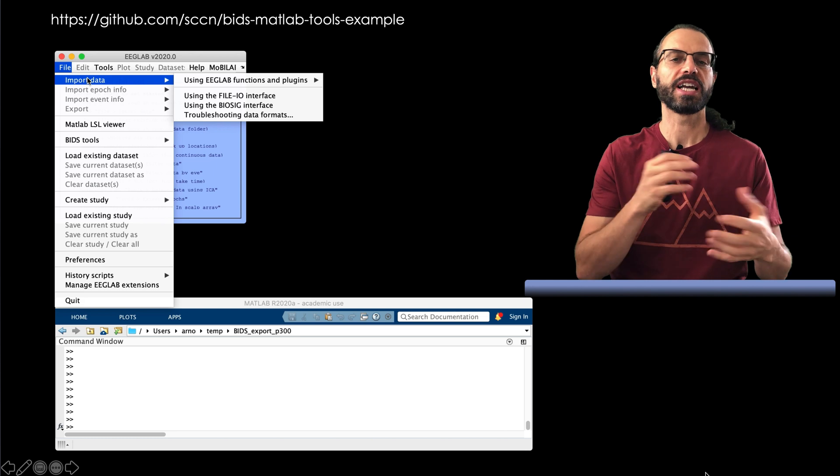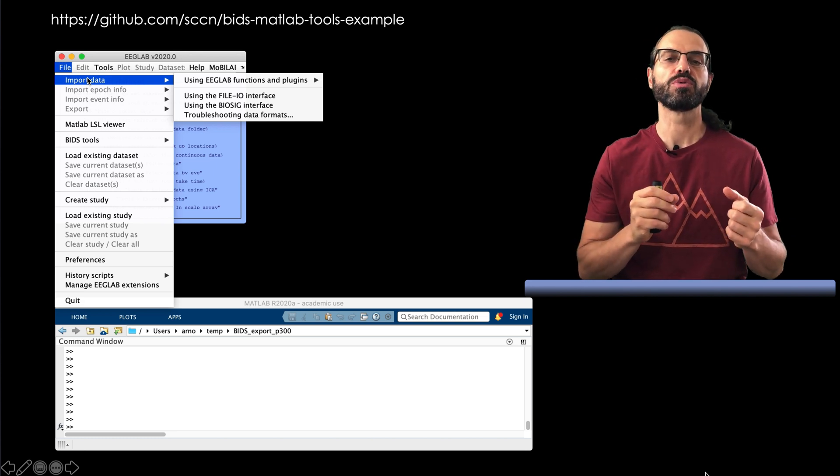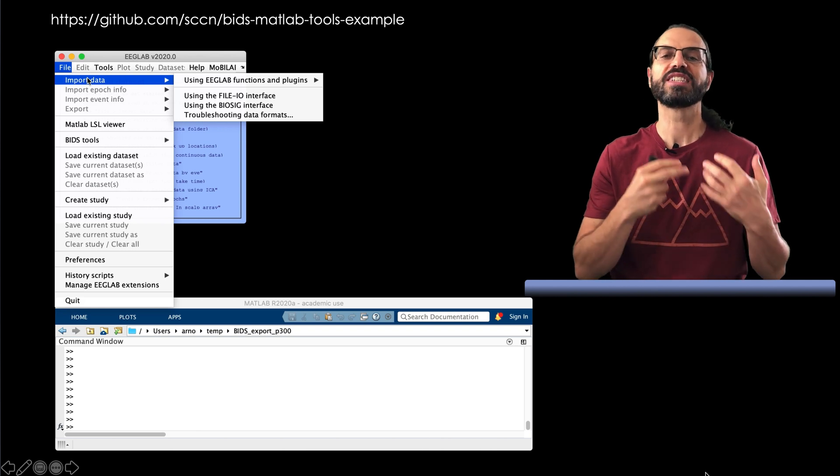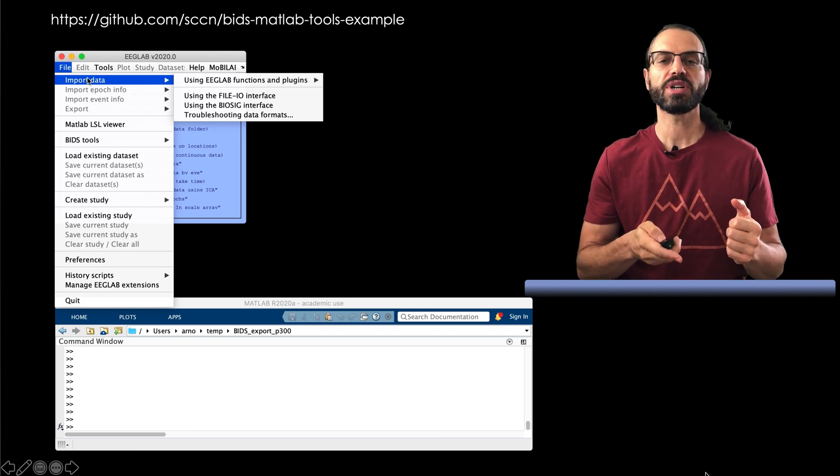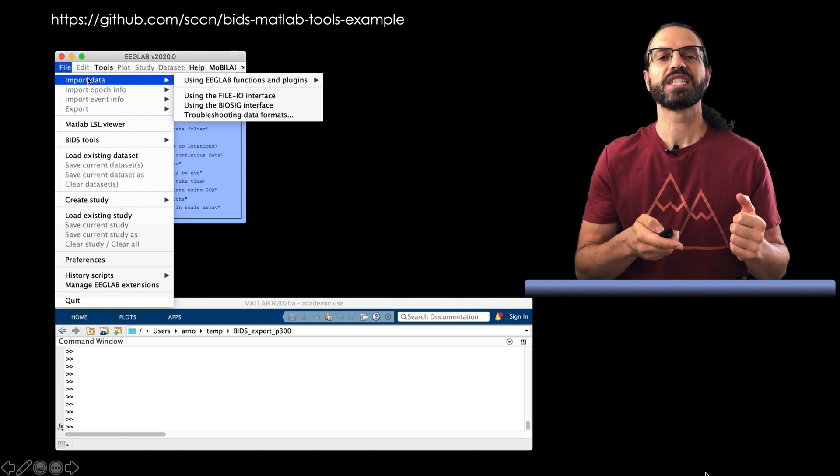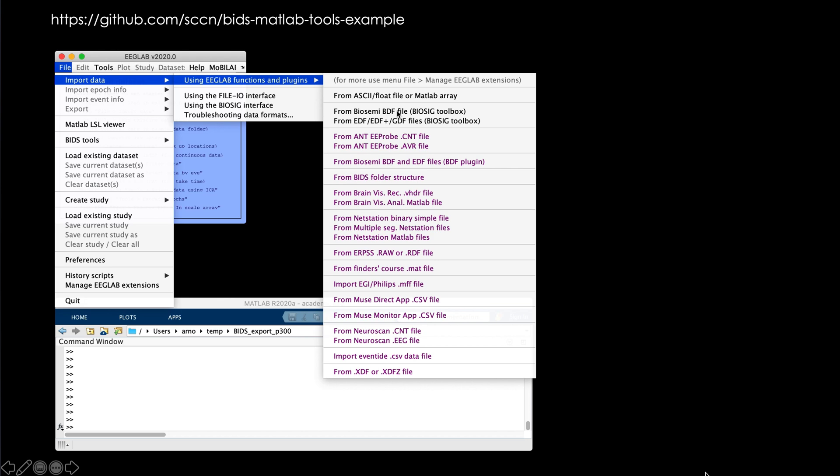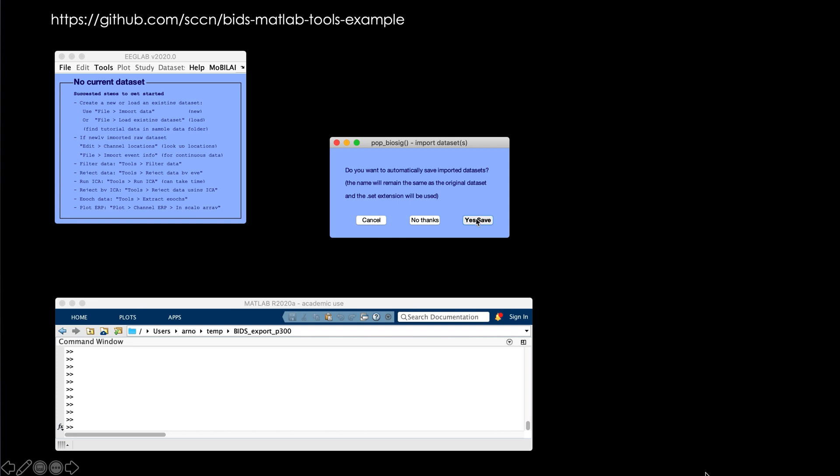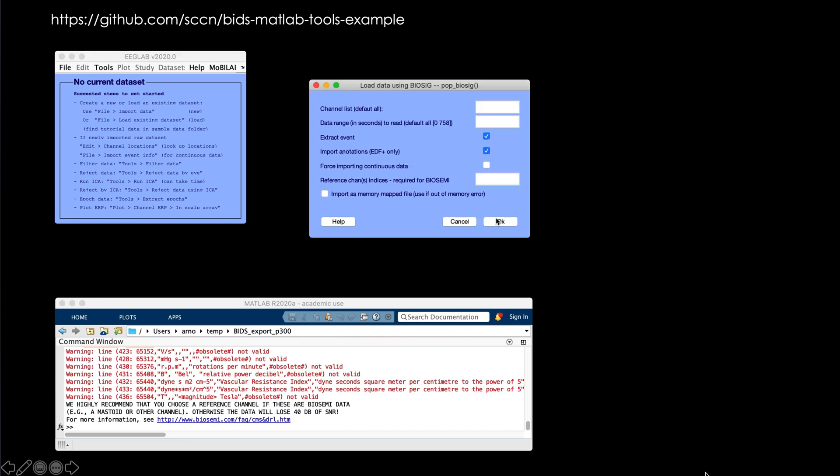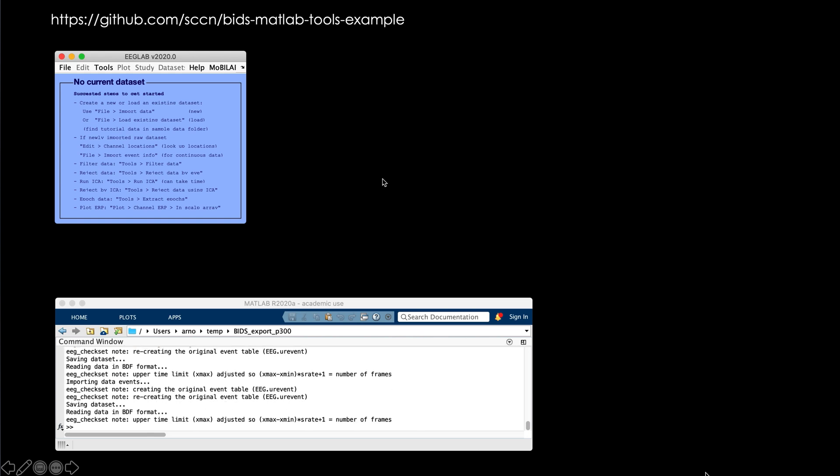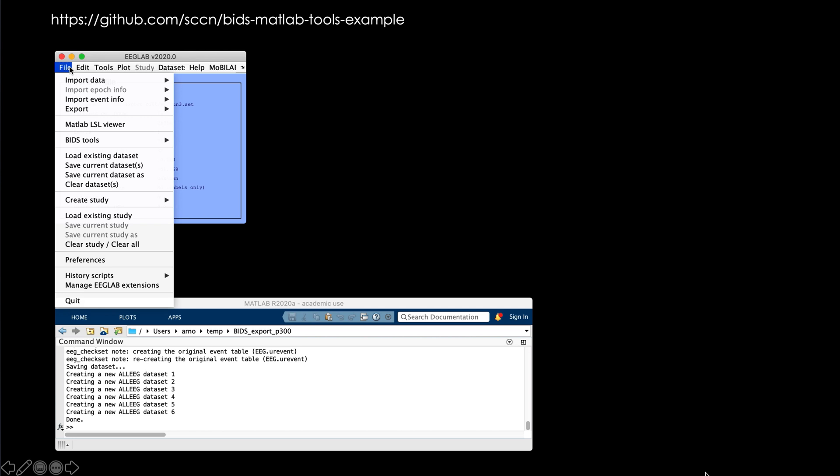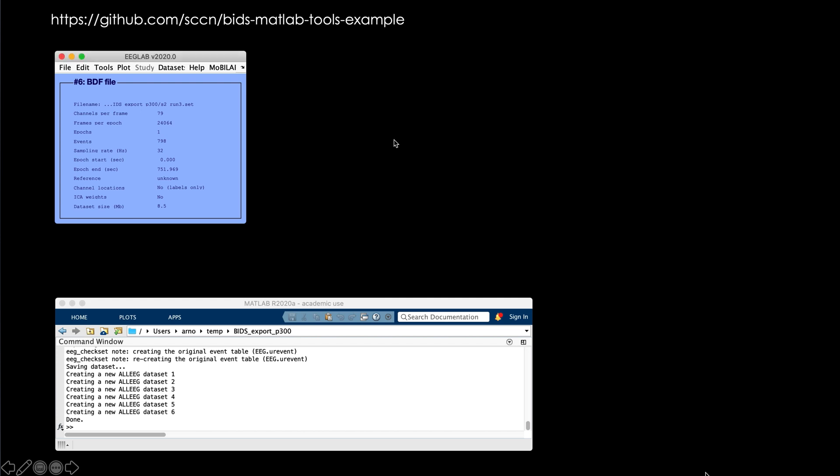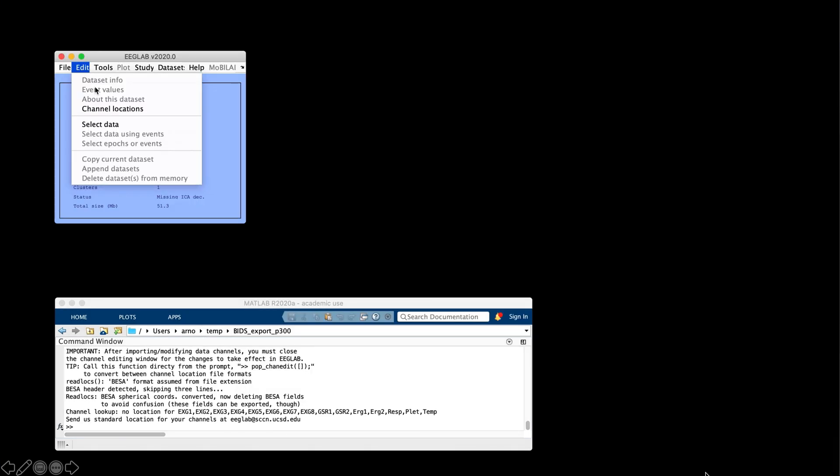There is no hard definition. This is what I like to use, and I think most EEG researchers would agree. For runs in EEG, we're not removing the cap, but for EEG sessions, we're removing the cap. So let's import these six data files. These are BDF files, which is a specific research amplifier and data collection program. I'm selecting them here and then simply agreeing to import them with the default option. I'm also agreeing to save the file on disk as EEGLAB datasets. Note that here I can import several files at once, but in older versions of EEGLAB, you have to import them one by one. Now we're going to create a study with these files. We enter subject and run information and press OK when we're done. And now we have the raw data files imported in EEGLAB.